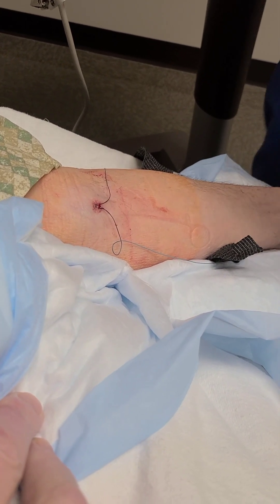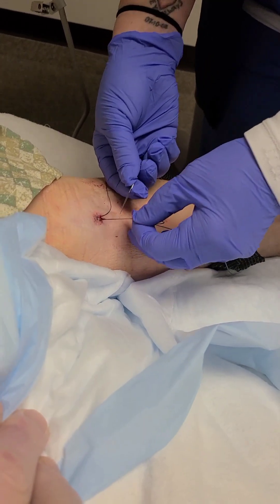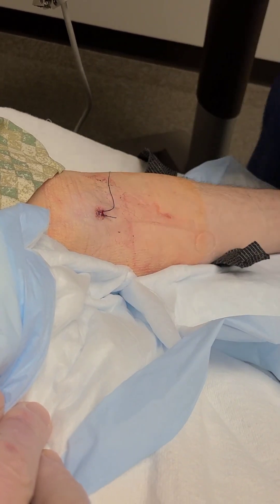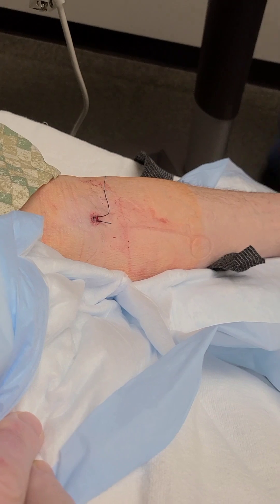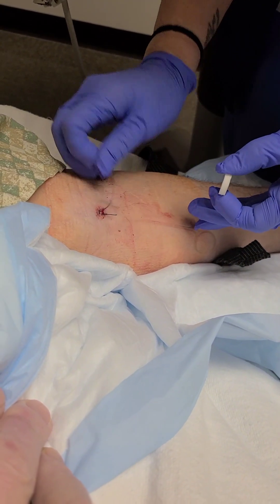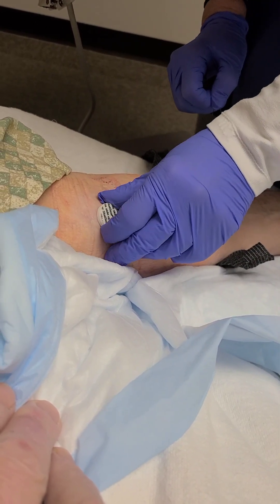So this is the same place that you would just cut with the scissors — if you had the suture removal kit. Cut that, and then pull it through. And then I set that there.